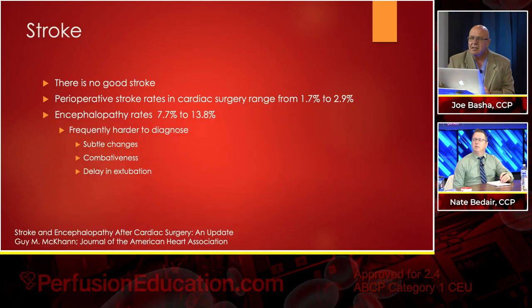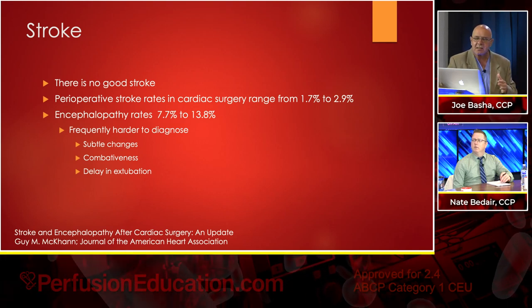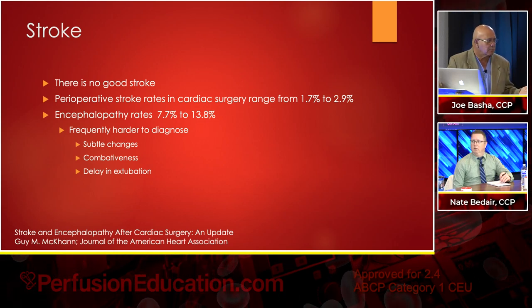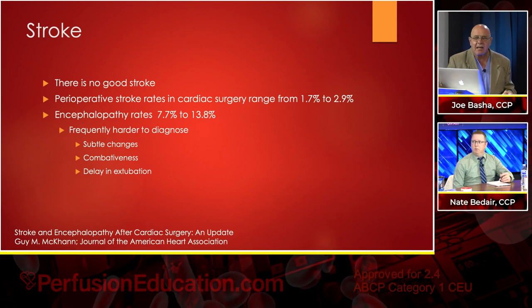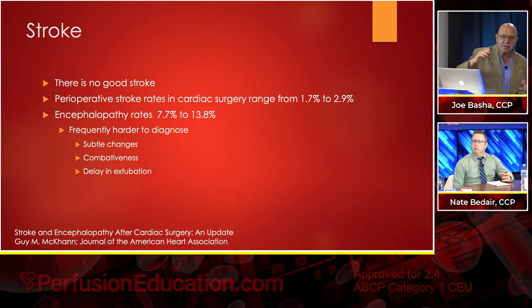As far as stroke is concerned, cerebral oximetry is trying to fill a need, and that's to help avoid stroke. I'm not going to say I don't believe in cerebral oximetry. I think it is a good device, but I think it has limitations. I think we need to recognize that it has limitations.